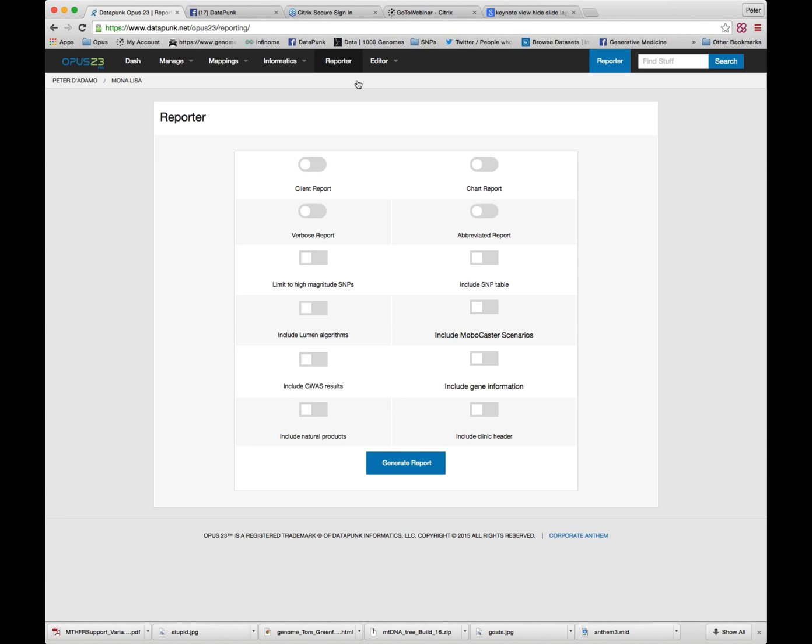So at this point, you might say to yourself, okay, now I've done all this and that. What am I going to do? How am I going to present this to the patient? How am I going to chart it? Well, when this is up and going, you would say, okay, I'm going to make a client report. I want it verbose. I want to limit it to high magnitude SNPs.